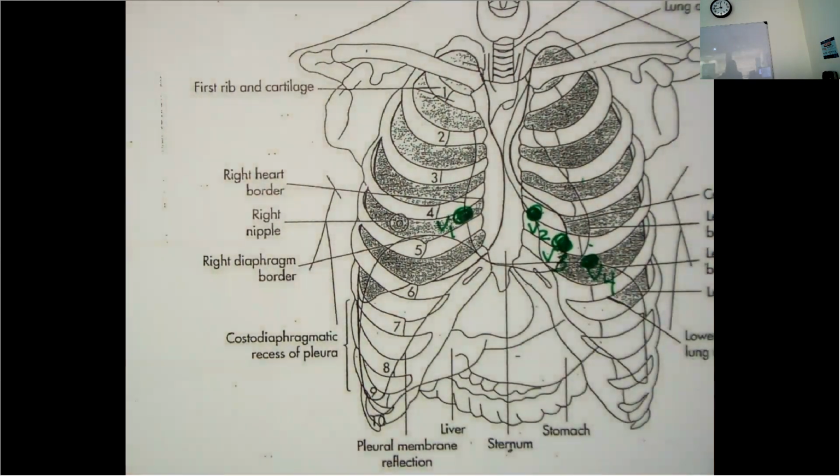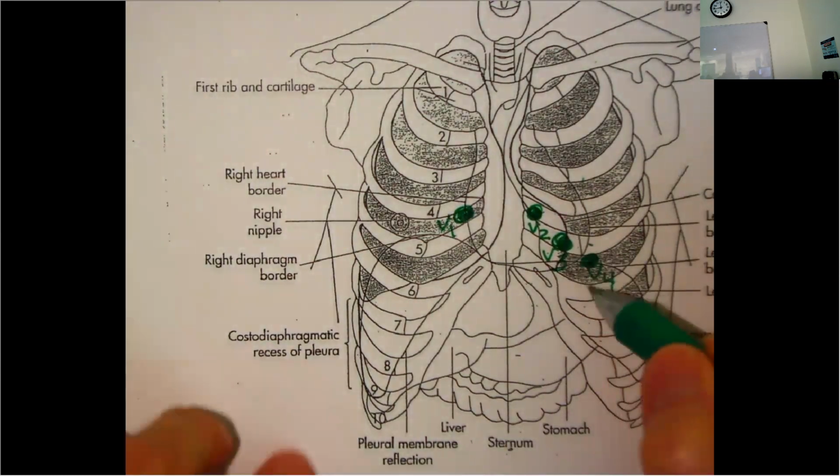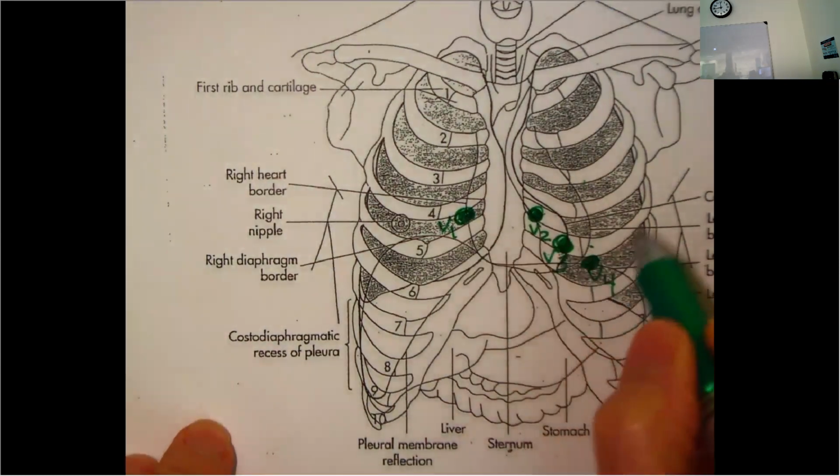Okay, then what do I do? Right, number 6 is next. Where does that go? Middle of the armpit, so mid-axillary, fifth intercostal space. So I follow 5 around to the armpit.